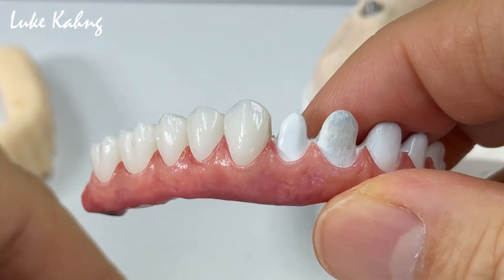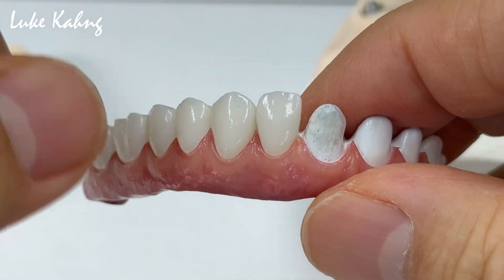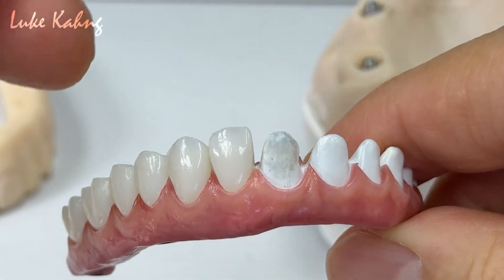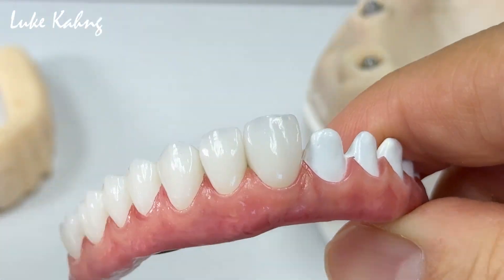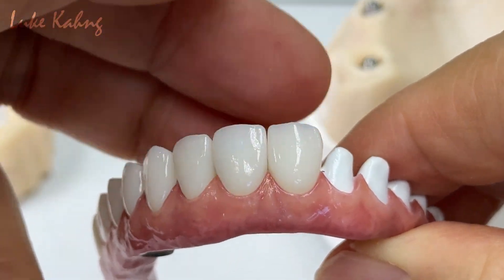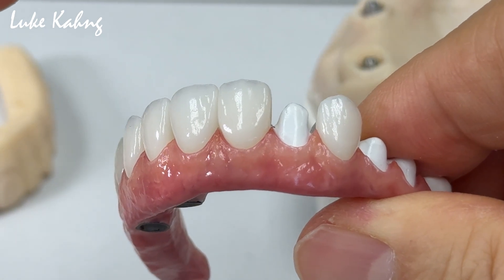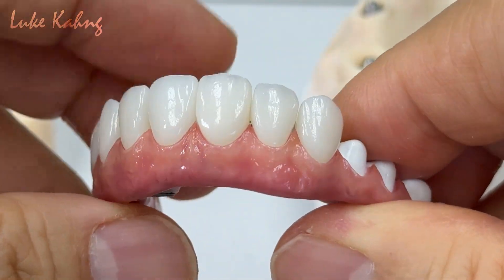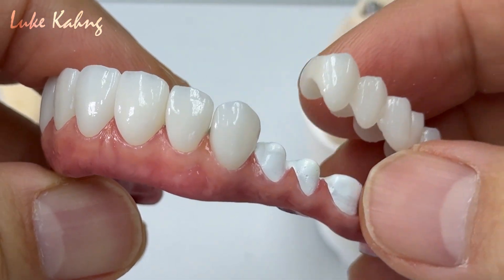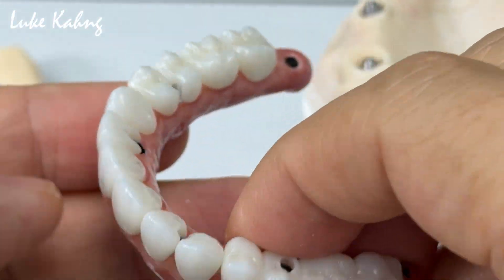Canine. Have one. And then central. This is monolithic, like I said. I'm going to make a pretty line here. And then four — four-unit bridge. So we're going to cement soon.